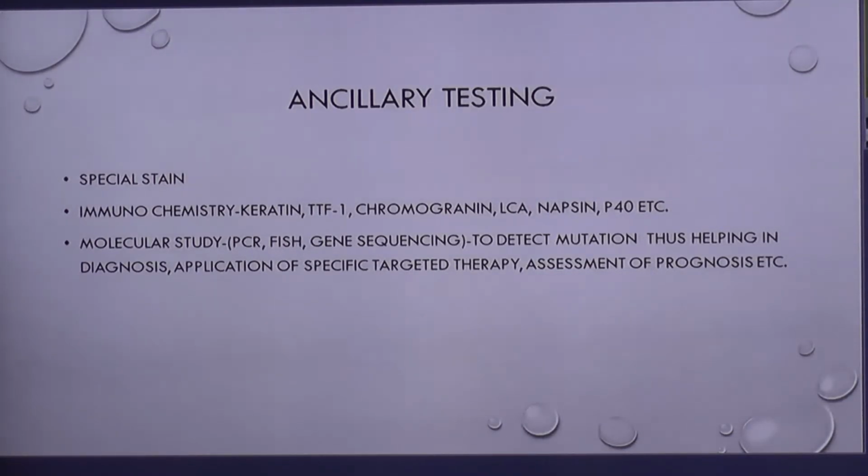Conventional or direct cytology smears in this sense have some advantages because of the intactness of cell nuclei and DNA quality, and thus direct smears may ultimately prove to be the cytology platform best suited for molecular techniques.